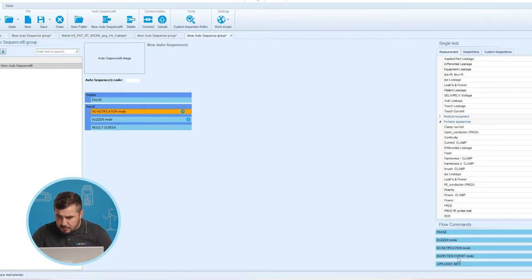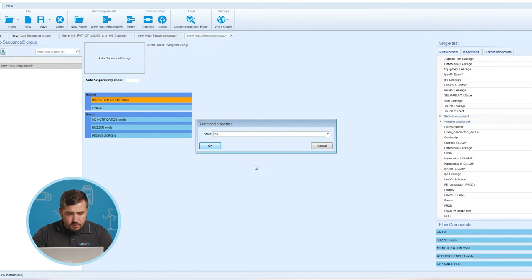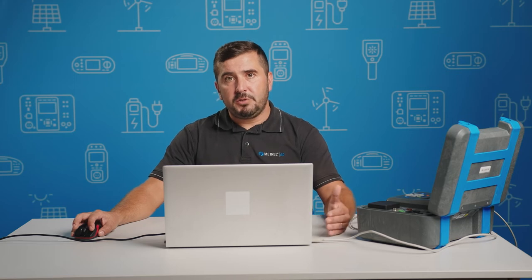The next flow command from the list is Inspection Expert Mode, which again has states On and Off. When it is set to state Off, the visual inspection screen and functional inspection screen within the auto sequence are displayed for one second, and an overall pass is automatically applied at the end of the test. In between, the automatic procedure can be stopped and statuses can be applied manually. Inspection Expert Mode is disabled by default.